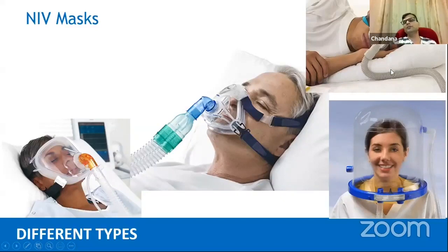So this is the domestic device applied for obstructive sleep apnea. This is the device we use, but it is actually available in certain hospitals. And don't try to use this device in a critically ill patient. This is just for obstructive sleep apnea. I have seen in certain peripheral hospitals, some people actually use this device. I was astonished to hear that when I went to do a certain workshop, and they only had this device. And they have tried to apply it on certain critical patients.